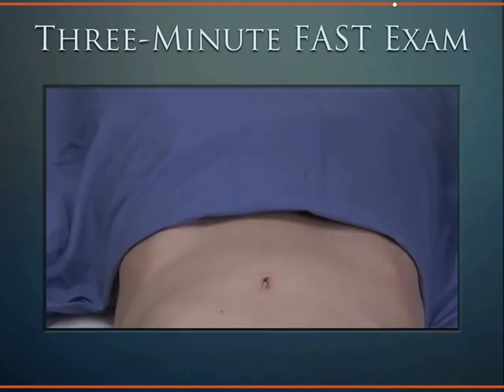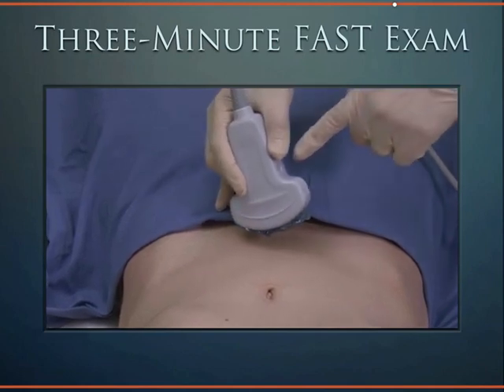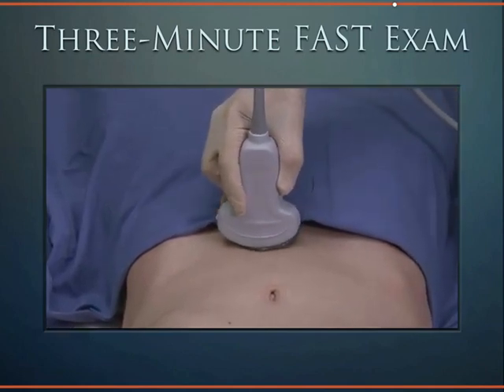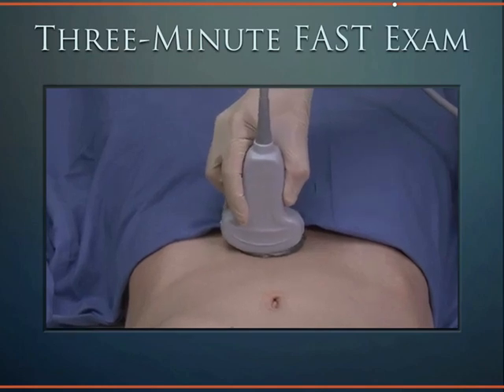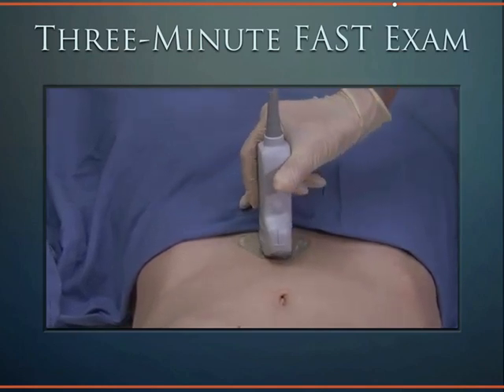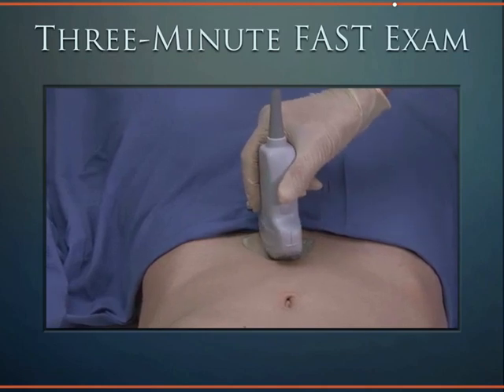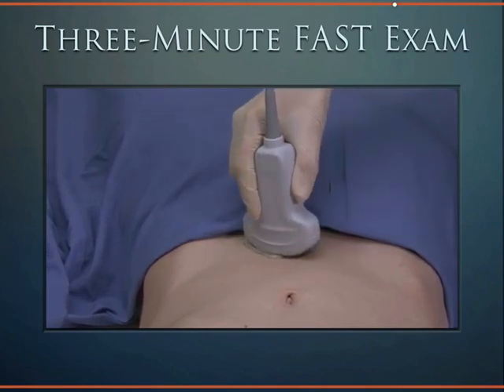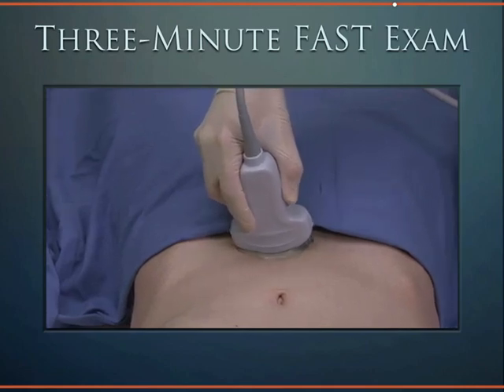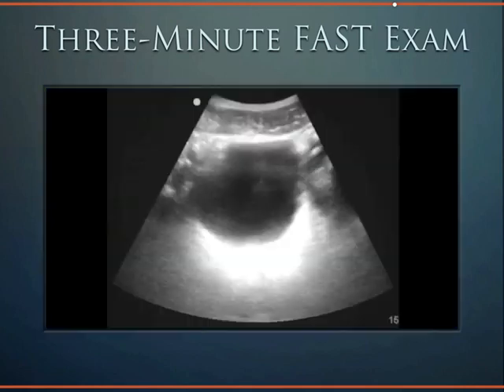The final window of the FAST exam is the suprapubic window. This window is comprised of a transverse view with the indicator to the patient's right, and then a sagittal view with the indicator to the patient's head. In the transverse view, fan all the way from side to side to obtain the complete window.